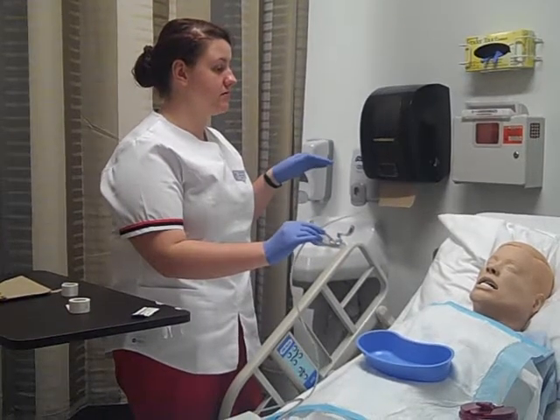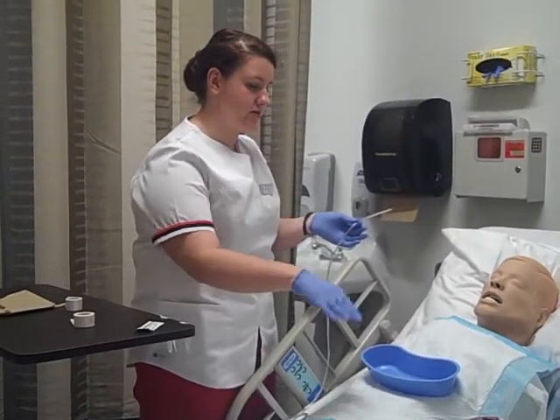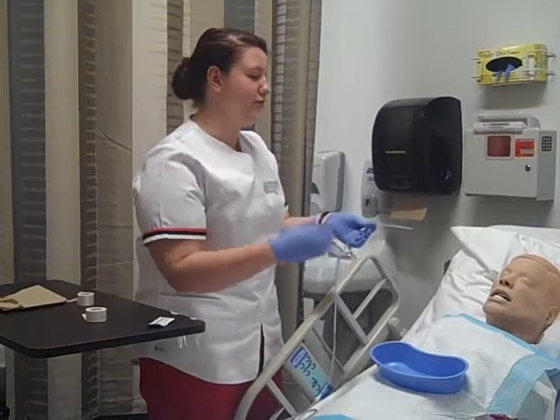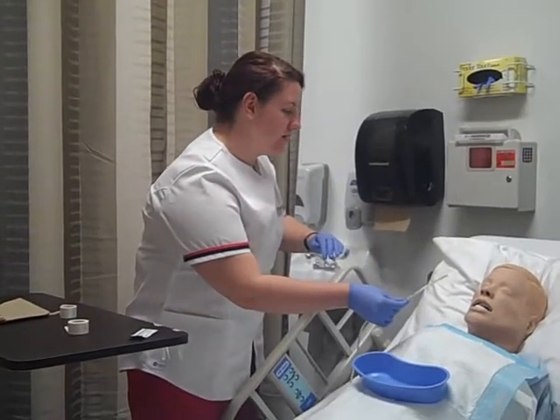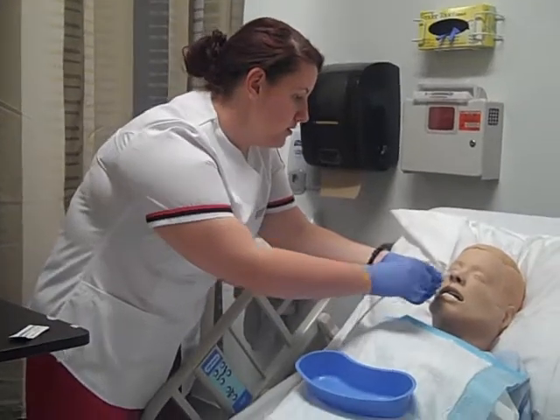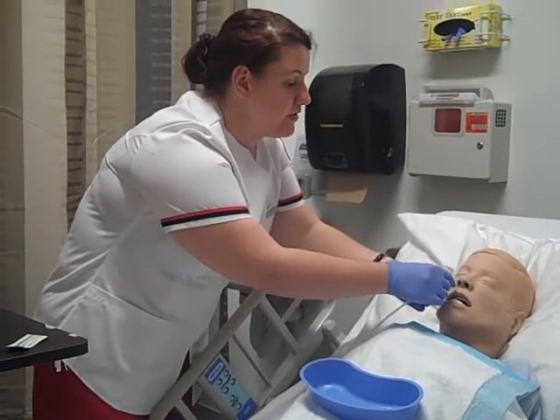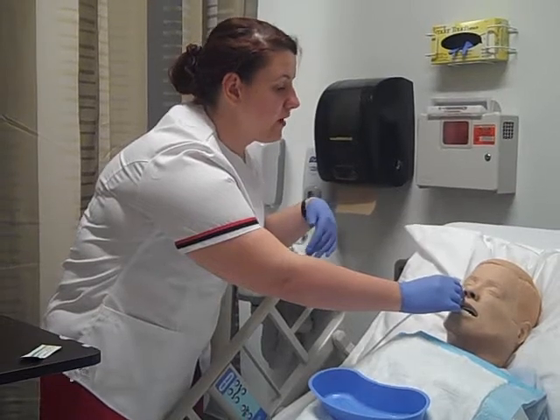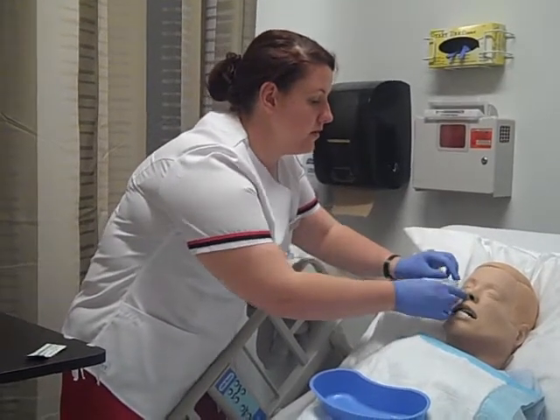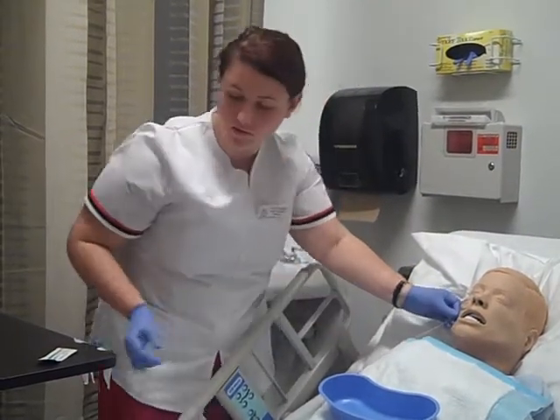And when I get resistance, I'm going to need you to flex your head forward for me. Okay, and remember, here's your basin and your cup — I'll tell you when to swallow. Okay, here we go. Miss Amy, I'm inserting it up towards your septum, and now I feel resistance. Could you raise your head forward for me? Okay, and you can use your water cup to swallow for me. Continue to swallow, swallow, swallow. Good job, thank you. And I'm going to tape it right to your cheek.